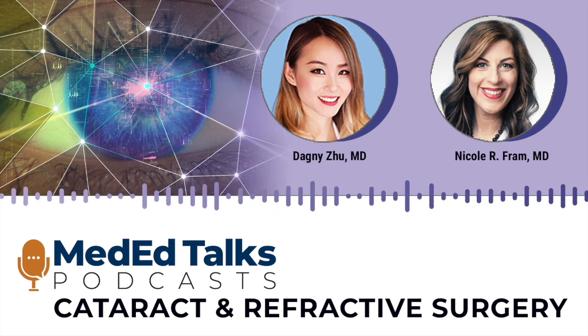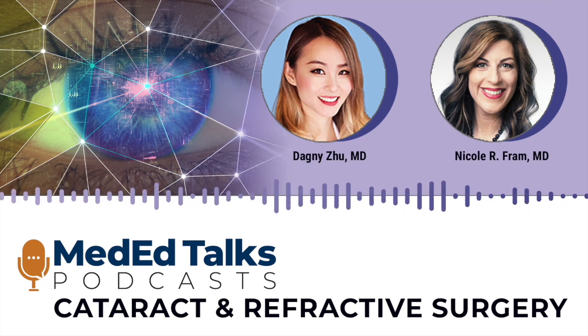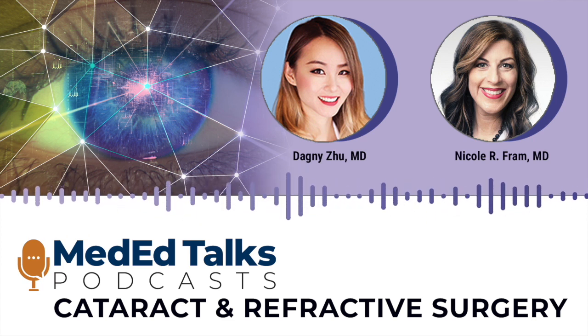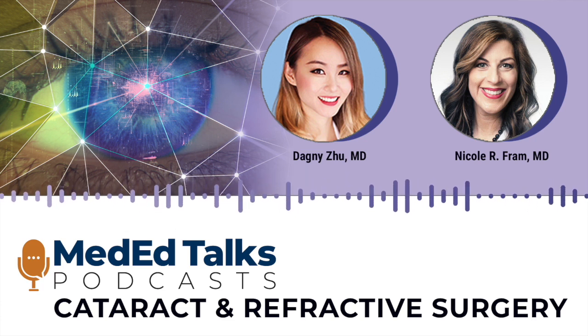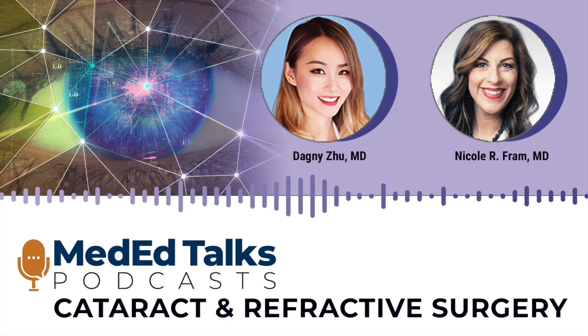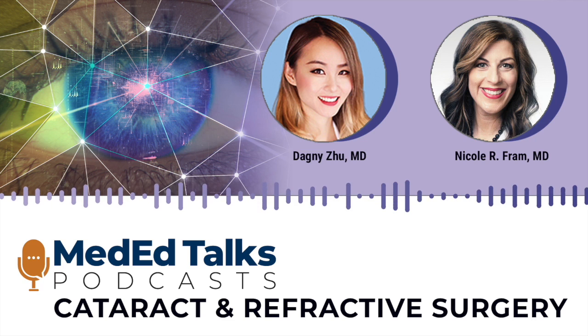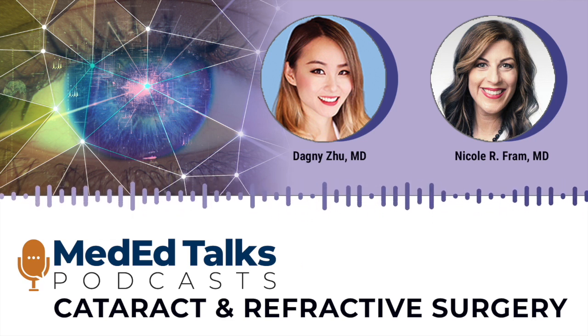Yeah, same here. I think we can never have enough technology to better refine our screening abilities. And often I need that tiebreaker, similar to what you use Aura for. I use epi mapping as a tiebreaker of whether I can safely perform corneal refractive surgery in a patient or not. And very often I've seen suspicious inferior steepening, but I don't see a corresponding posterior elevation. And then when I look at epithelial thickness mapping, oh, that area that was steep is also thick. The epithelium's thick there. So then I'm comfortable knowing that, okay, this is probably not ectasia, it's probably contact lens warpage. So I totally agree.